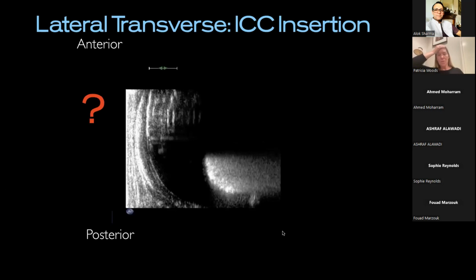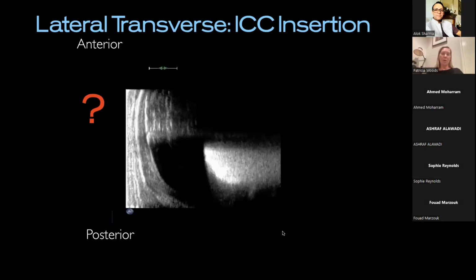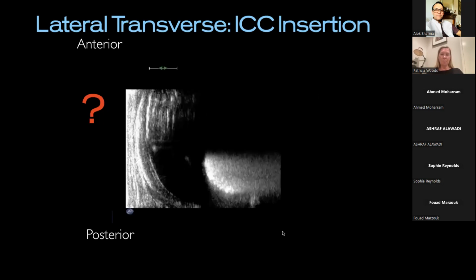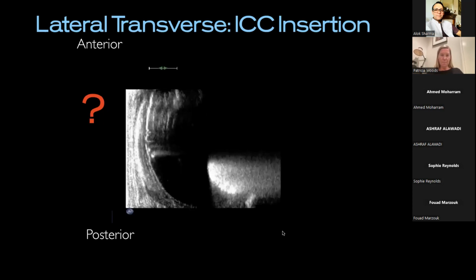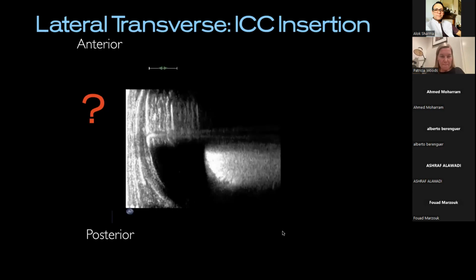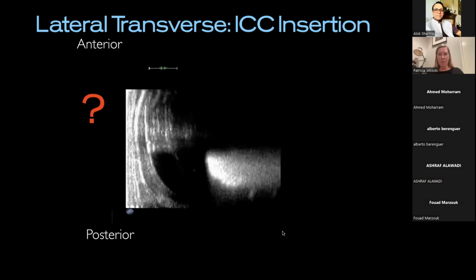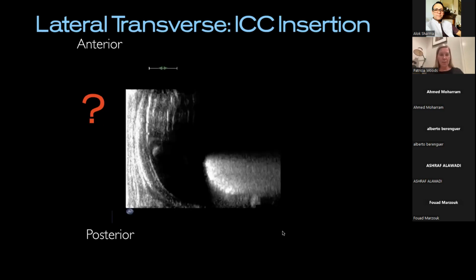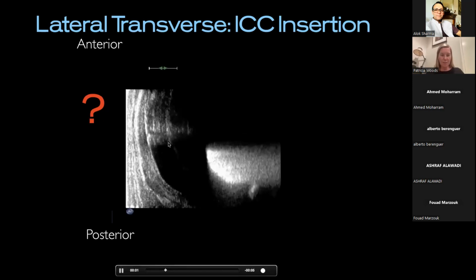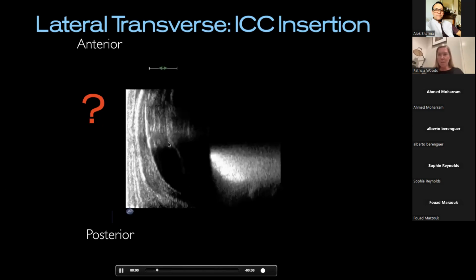Can I ask someone to interpret this for me, please? Exactly the same plane, and I think we've got a new artifact that you should be observing. Needle. Needle. It can be really quite hard to sometimes visualize the needle and chest catheter going through. Have a guess. Having a look at that chest wall surface, can you introduce some air to the space as well? Yeah, we've kebabbed the lung instead.